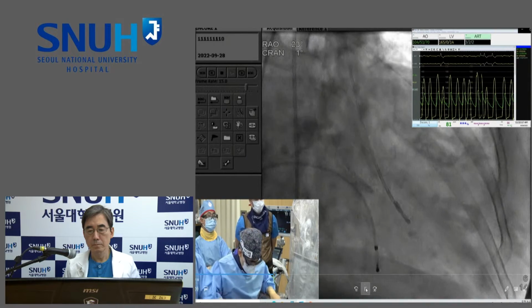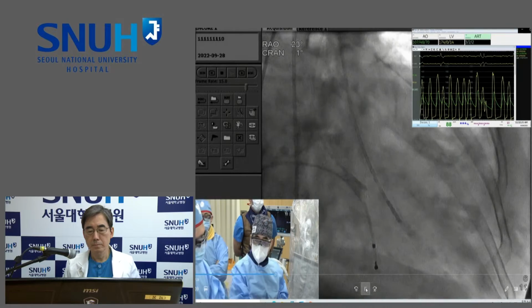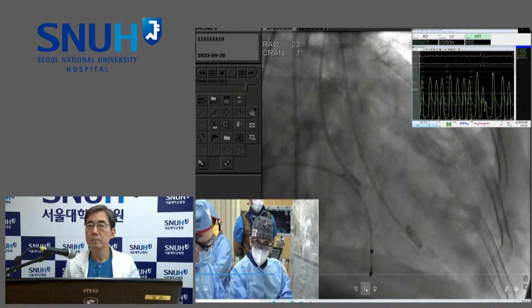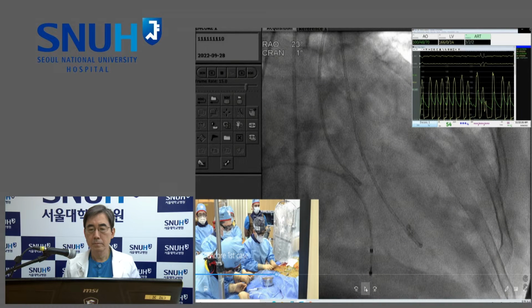I've seen some, obviously, in some other live cases. I think they summarized fairly nicely some of the advantages here. This case, I haven't seen anything. This case would seem to me to be one that could be treated with any of the commercially available valves. I think in the United States today, we don't have the Neo 2.